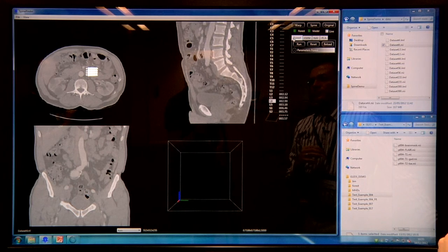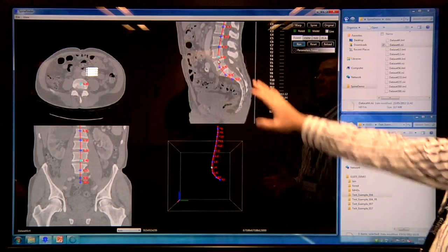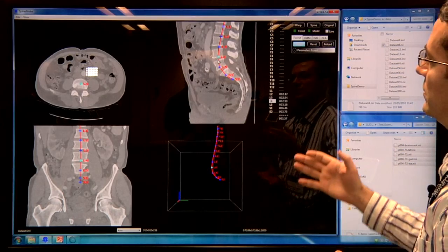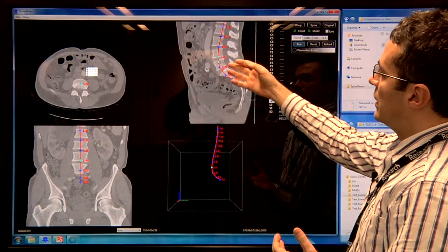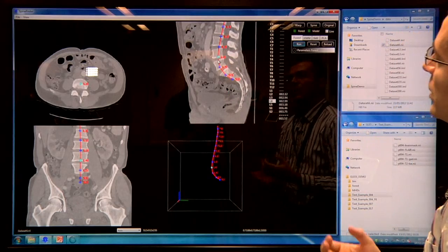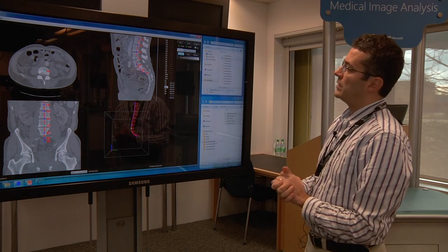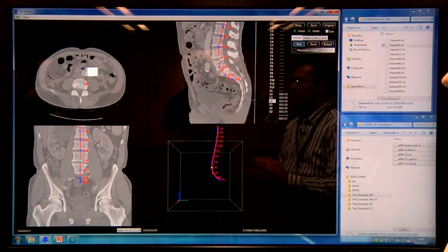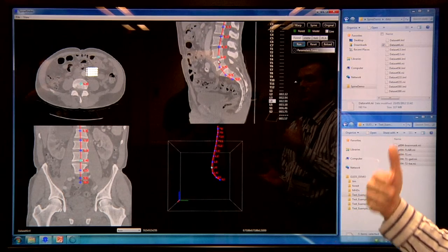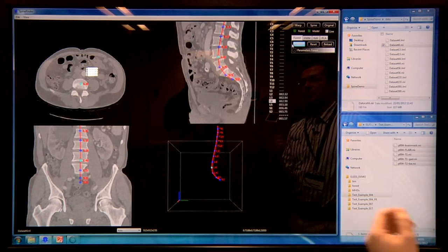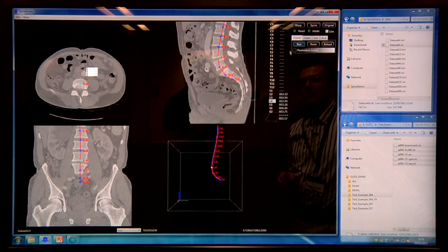What we do first of all is automatically identify the spine. The spine is important to identify, not just to be able to analyze whether there are broken vertebrae, but also because the spine is a natural coordinate system for the patient — very helpful for any doctor who wants to look at these images. I've clicked the run button and something has already happened very quickly, but it's not quite as refined as it could be.